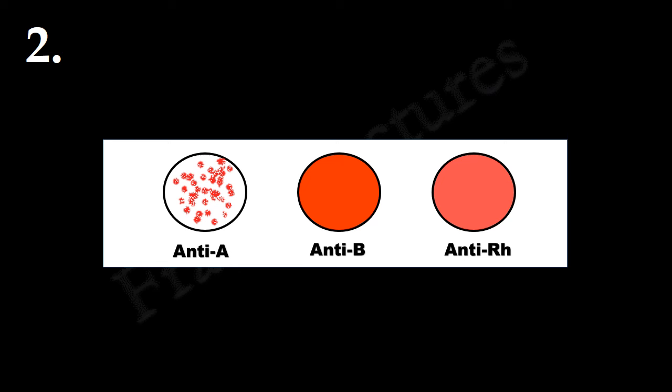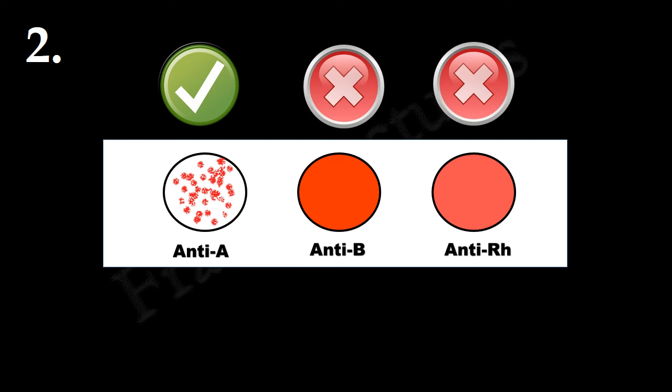Here, agglutination is observed only in the anti-A circle, which means antigen A is present on RBCs. No agglutination in the anti-B and anti-RH circles, so B antigen and RH antigen are absent. Therefore, blood group will be A negative. Recall that the minus sign indicates that RH antigen is absent.